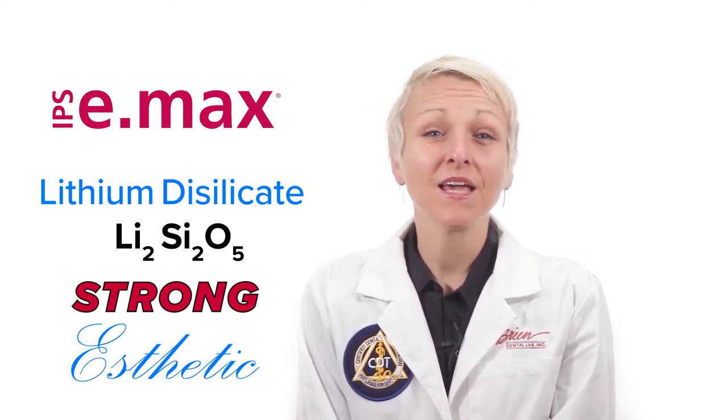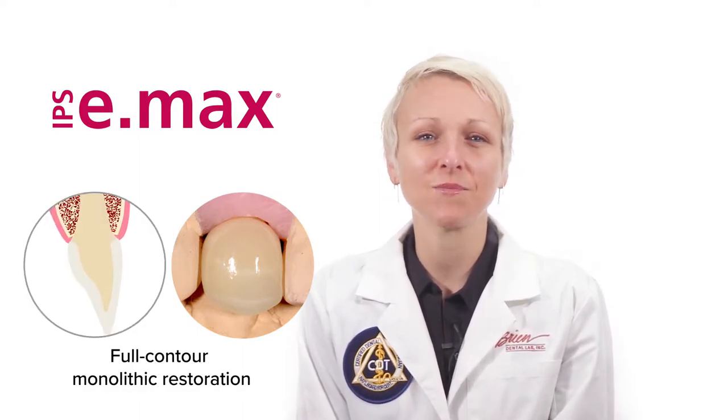Emax is a trade name for lithium disilicate, which is a glass ceramic that is both strong and aesthetic. Emax is so aesthetic, in fact, that it doesn't require veneering ceramic and instead can be built as a full contour monolithic restoration.